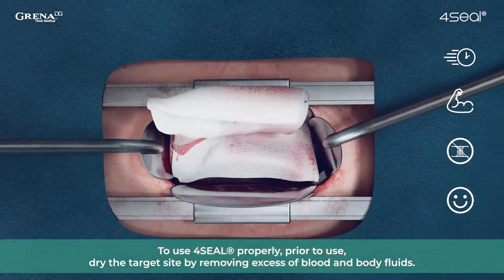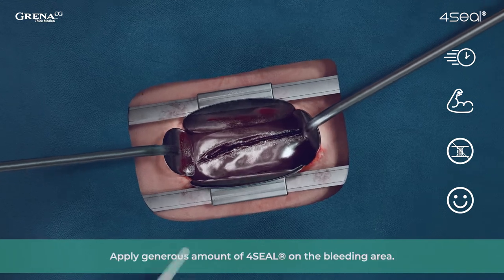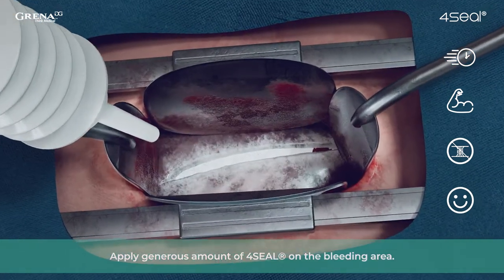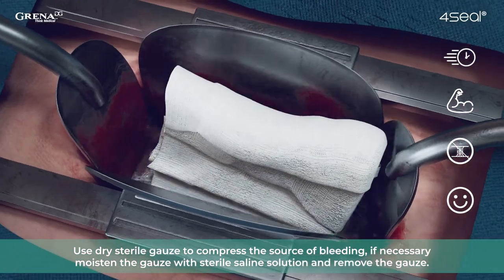To use 4Seal properly, prior to use, dry the target site by removing excess blood and bodily fluids. Apply a generous amount of 4Seal to the bleeding area.